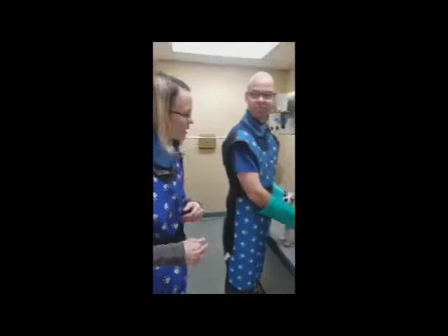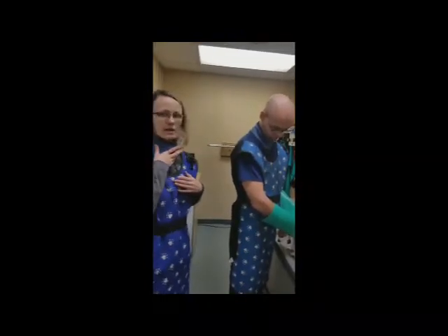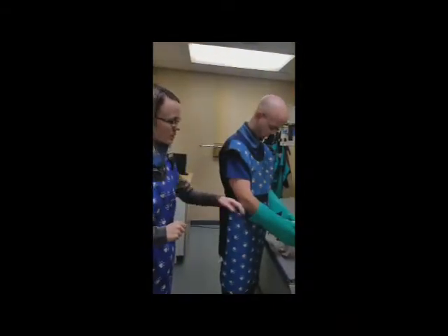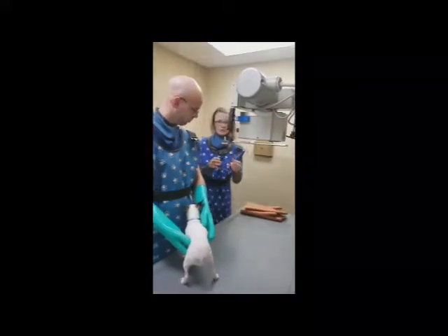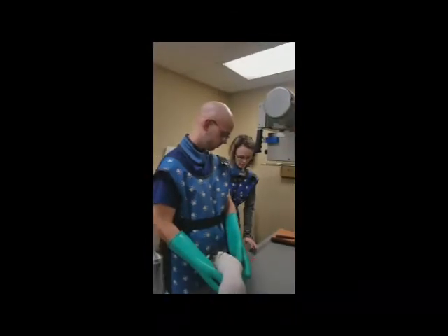This is Bronson — he's our helper. We both have our lead gowns on, our thyroid collars, and our badges right at the top. We're going to do a right lateral. This is our marker — we're going to put that in the picture. We'll turn the lights off, make the beam a little larger, and then put her on her side.